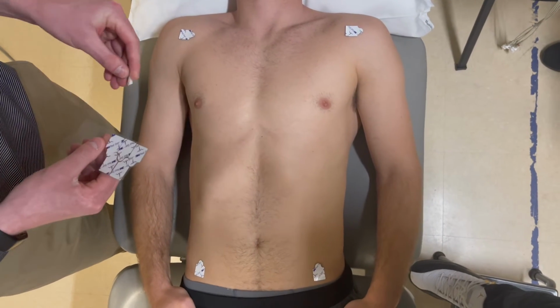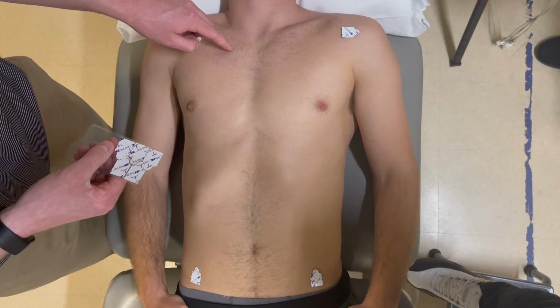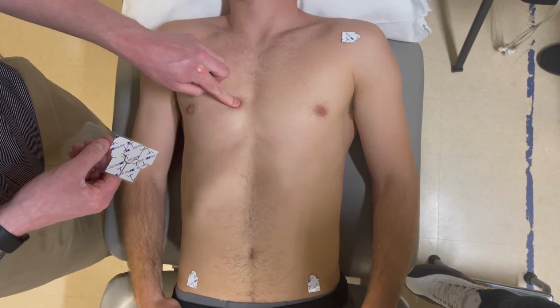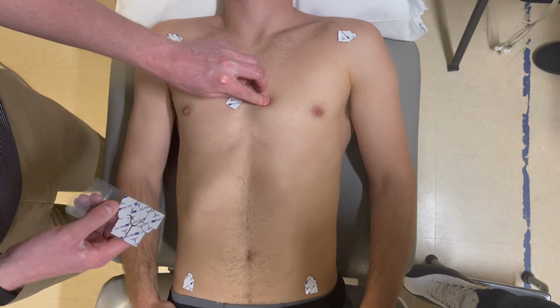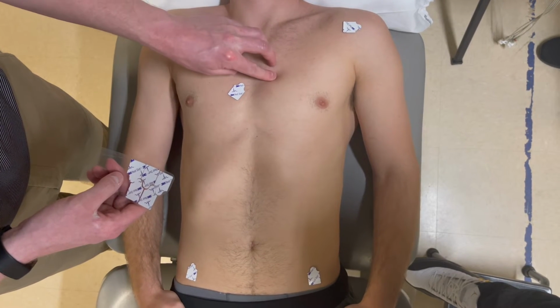Now we will be doing the precordial electrodes. The first one is called V1 and is placed in the 4th intercostal space to the right of the sternum. The second one is called V2 and is placed in the 4th intercostal space to the left of the sternum.